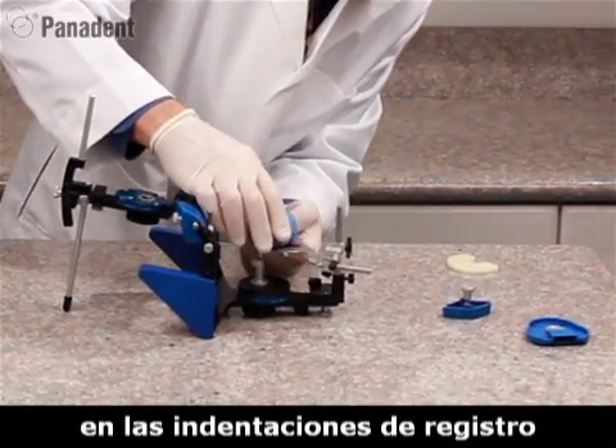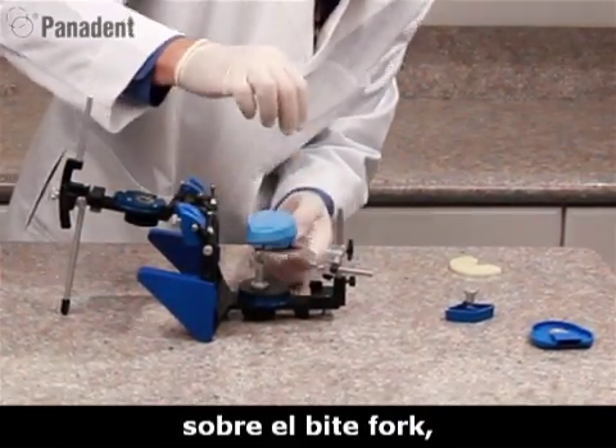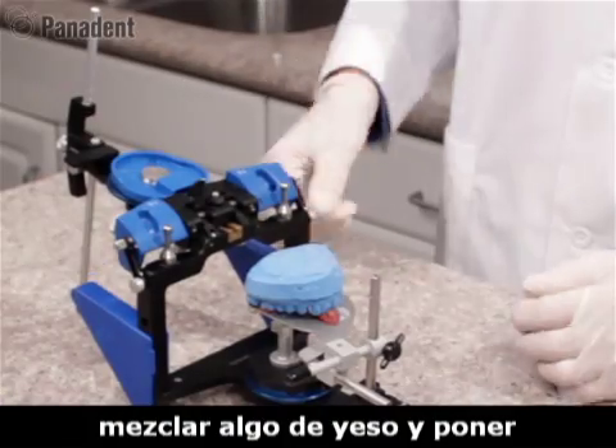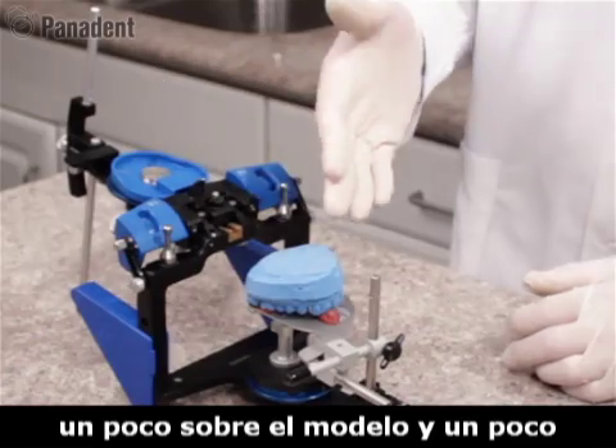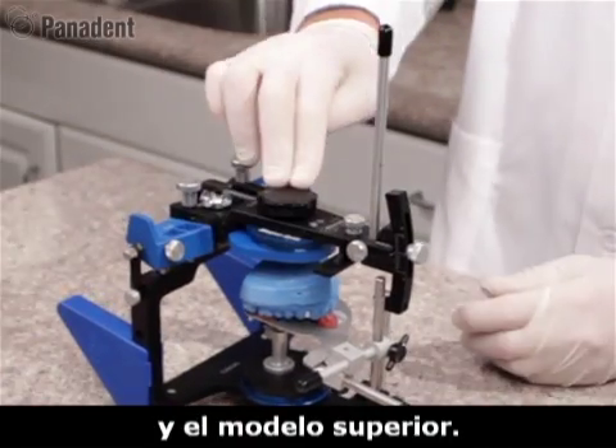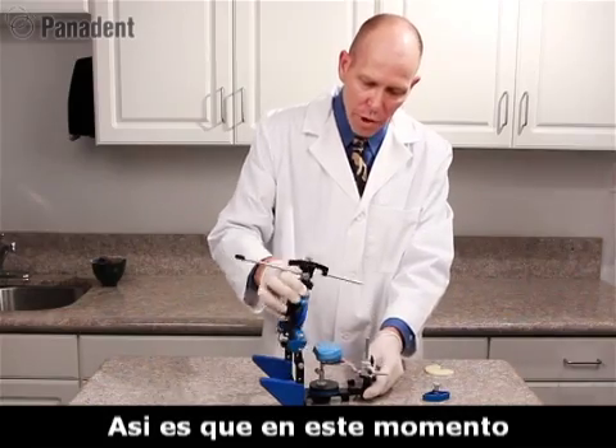We can now add our cast to the indentations on our bifork registration, then add a mounting plate to the upper frame. We'll go ahead and mix some plaster and add it to the mounting plate and to the cast, making a connection of the upper cast to the upper frame of the articulator.